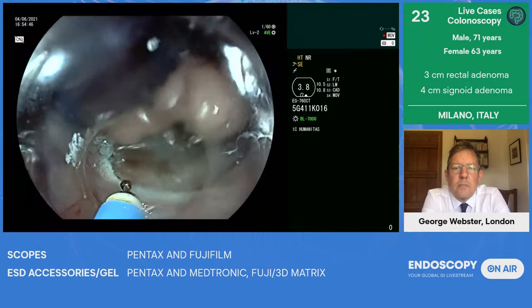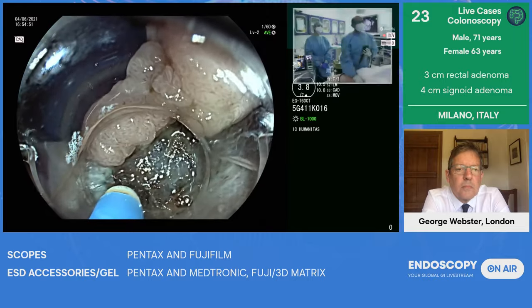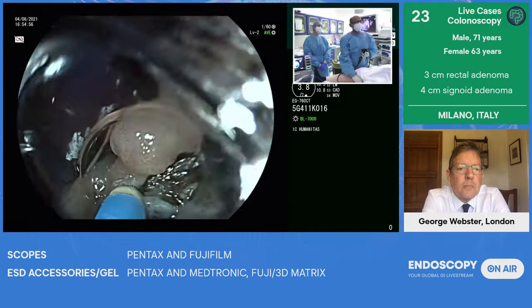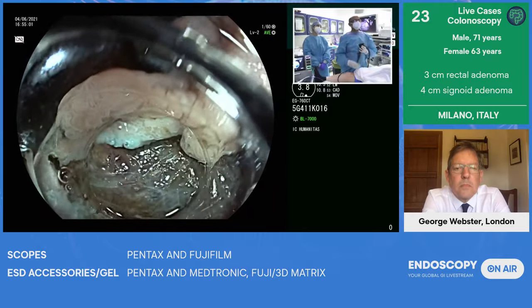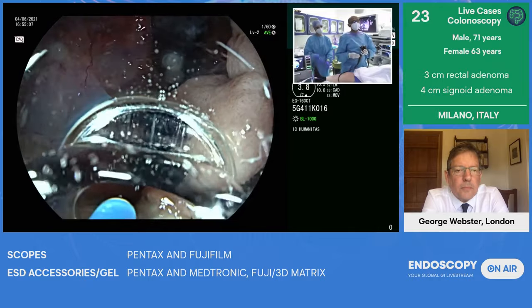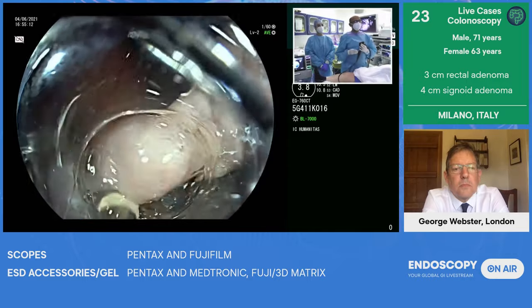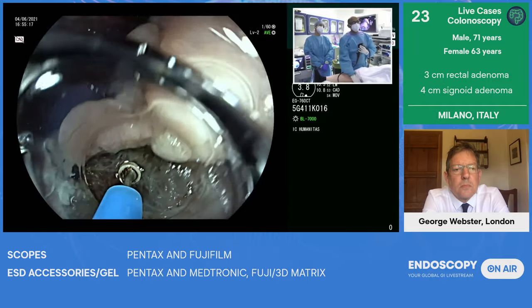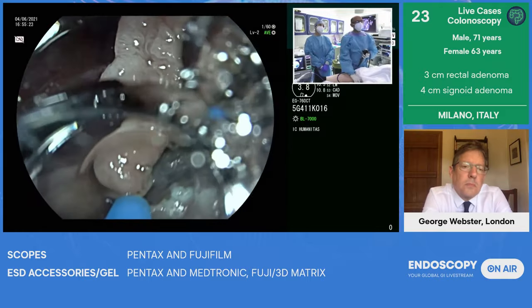Here is the needle type knife, George. What I'll show you in retroflexion is that we can use the needle type knife very well, but the knife is perpendicular to the muscle, and that increases the risk of perforation. It does the job, but the risk is high. So if you are an early starter in ESD, give me the ball type knife, please. You can make ESD safer, and you can change over to this version, where you see now the ceramic ball protects me against injuring the muscle.